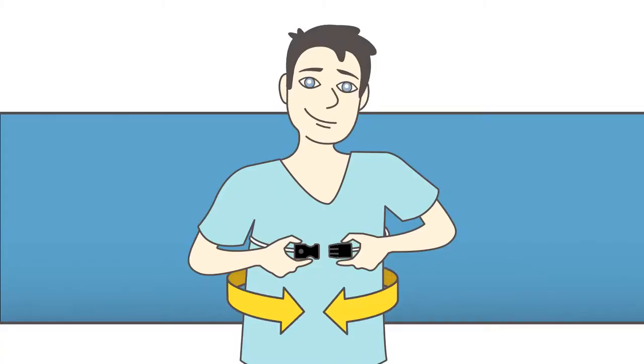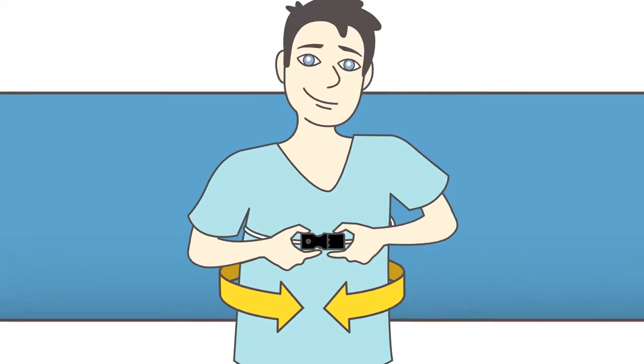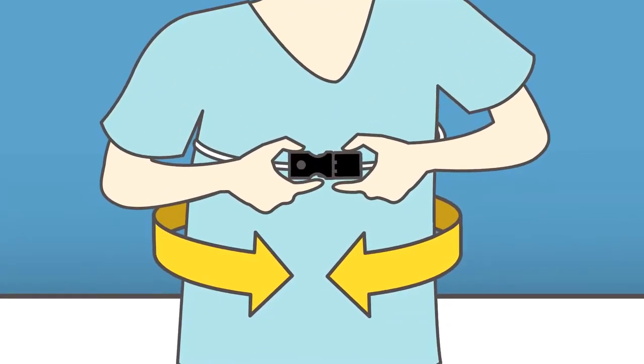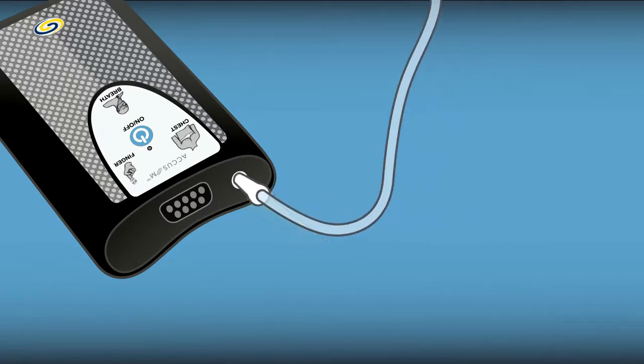First, wrap the chest sensor around your back and fasten the black clips together in front of your chest. Adjust the belt so it fits snugly under your breasts, then connect the other end to the Accusom.